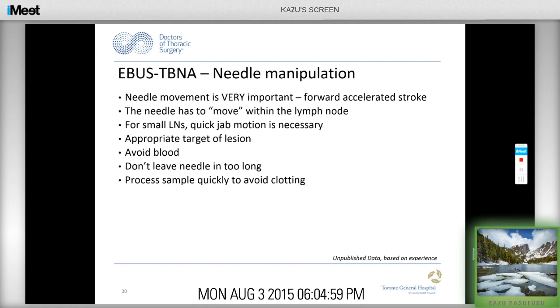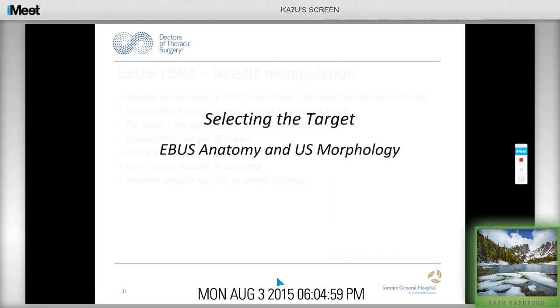To summarize needle manipulation for EBUS-TBNA: it's really the forward stroke that makes the biggest difference in the amount of tissue you can get. The needle has to move within the lymph node. For small lymph nodes, a quick jab motion is necessary. Target the lesion appropriately, avoid blood, don't leave the needle in too long, and process samples quickly to avoid clotting.